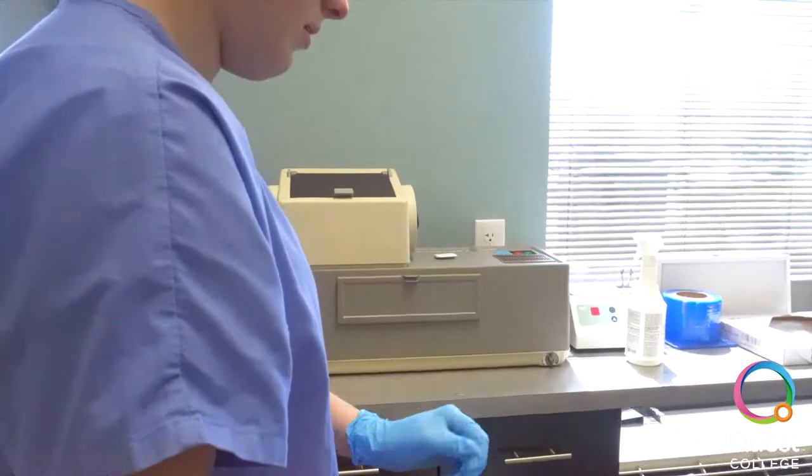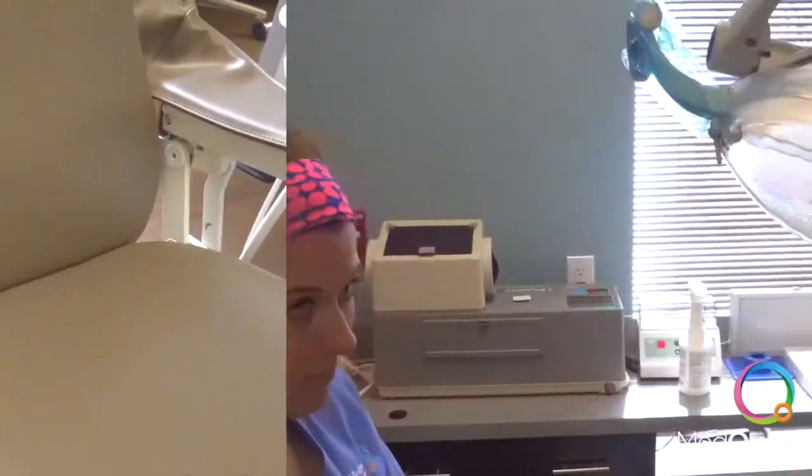First, prep the operatory room by putting on your gloves and taping the areas that may be used during the appointment.